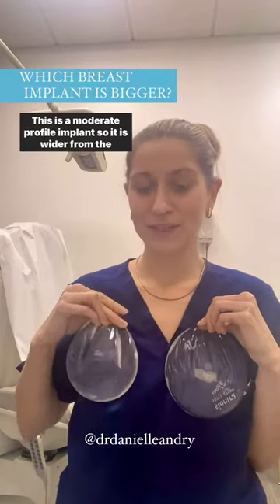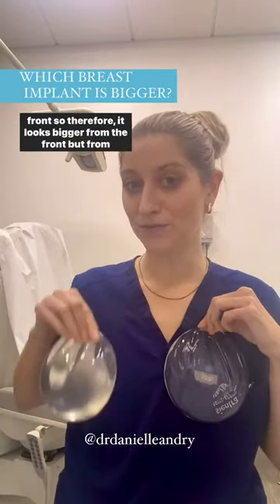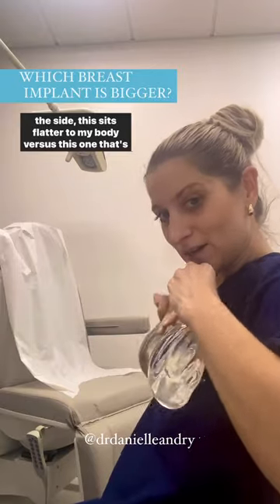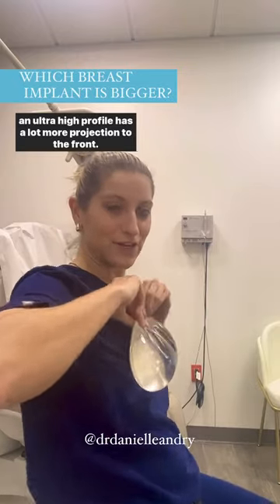This is a moderate profile implant, so it is wider from the front — that's what makes it look bigger from the front. But from the side, it sits flatter to my body, versus this one, which is an ultra high profile and has a lot more projection to the front.